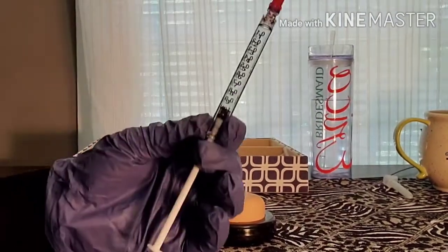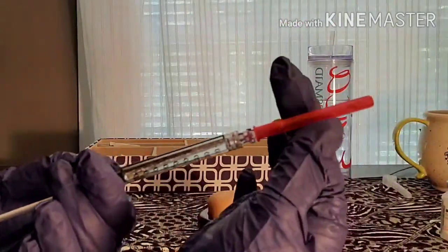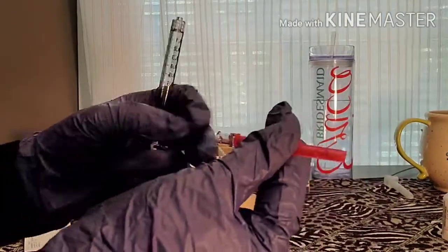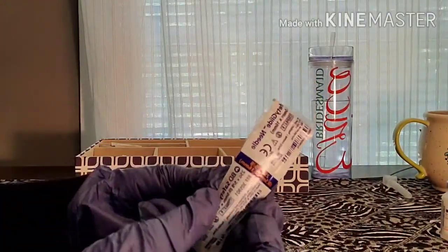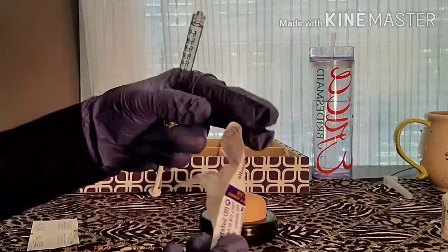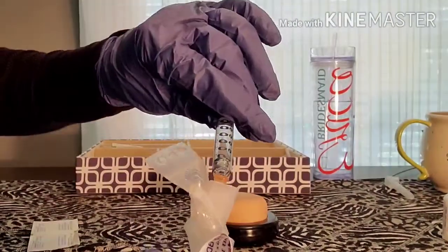My vial said 5,000 units per one milliliter and I want to give 5,000 units, but I don't want to use this blunt needle. I'm going to throw it in my sharps container and grab my 5/8-inch 25-gauge needle and connect it.